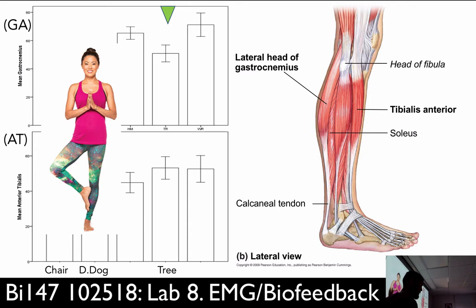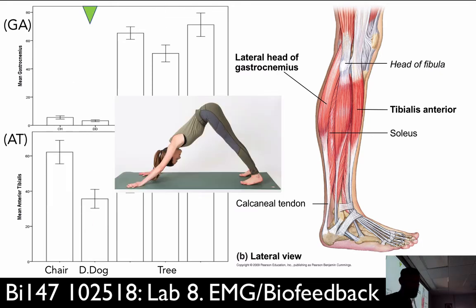Yep, standing leg. So we're doing this because it is a standing leg that's really accentuating the muscles around that joint, to stabilize that joint, because you don't have both feet on the ground. Both feet on the ground, knees locked, it doesn't take a lot of muscle to stand. One leg up, knee not locked, it takes muscles all the way around, all the muscles that control that ankle joint to stabilize that person, to balance. And you can see that here in the difference between that EMG and the ones for these others. Okay? So we're going to explore that.